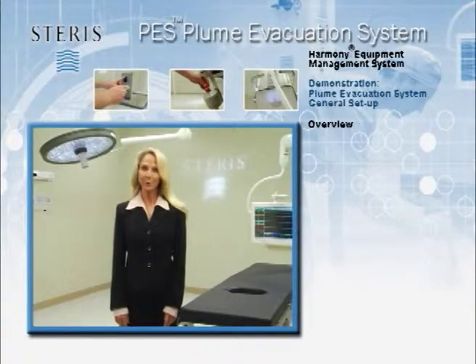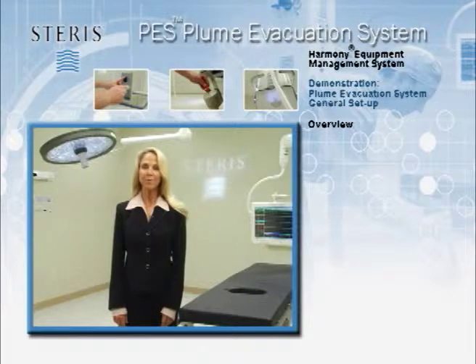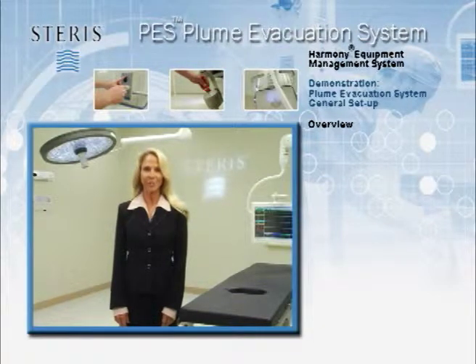The PES is an integrated plume evacuation system for the Harmony EMS column unit. The motor for the system is discreetly located in the ceiling, taking up zero operating room floor space. Its remote location also makes the unit very quiet, minimizing surge and distraction.